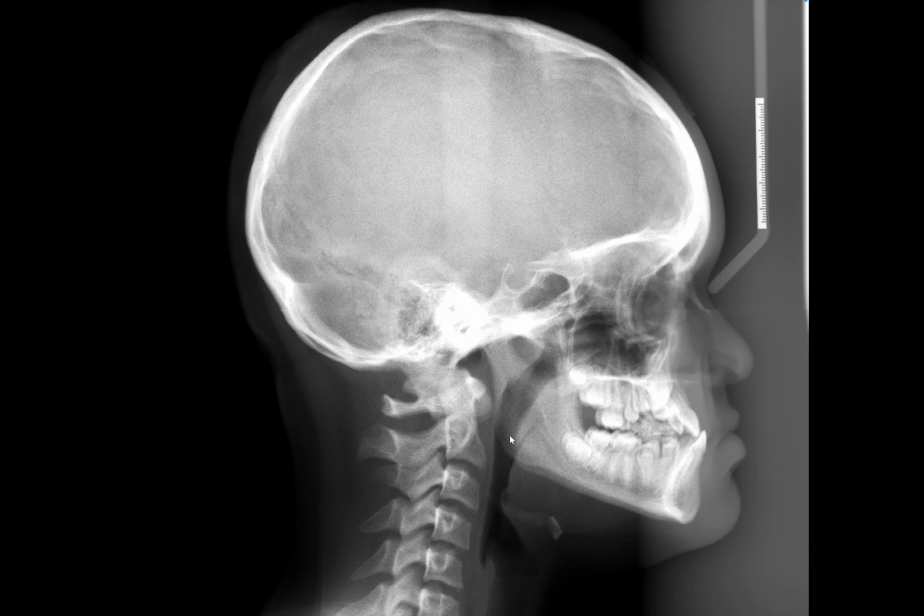And this patient, in this case, is relatively well positioned. But if you look at the inferior border of the mandible, you can see two outlines, right? One here and one there. And also, obviously, the teeth do not overlap to the right and left side very well because the eruption status from the right and left is always slightly off.